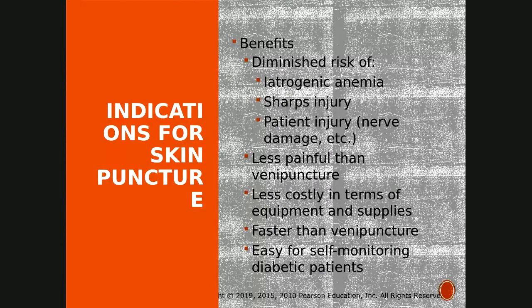necessary labs that would be associated with capillary specimen collection, explain why the capillary blood from a skin puncture is different than blood taken by a venipuncture, identify the proper sites for performing a skin puncture procedure and explain why it's necessary, describe the procedure for a skin puncture, and also describe the purpose and procedure for making blood smears as characteristic of acceptable. So indications for skin puncture.